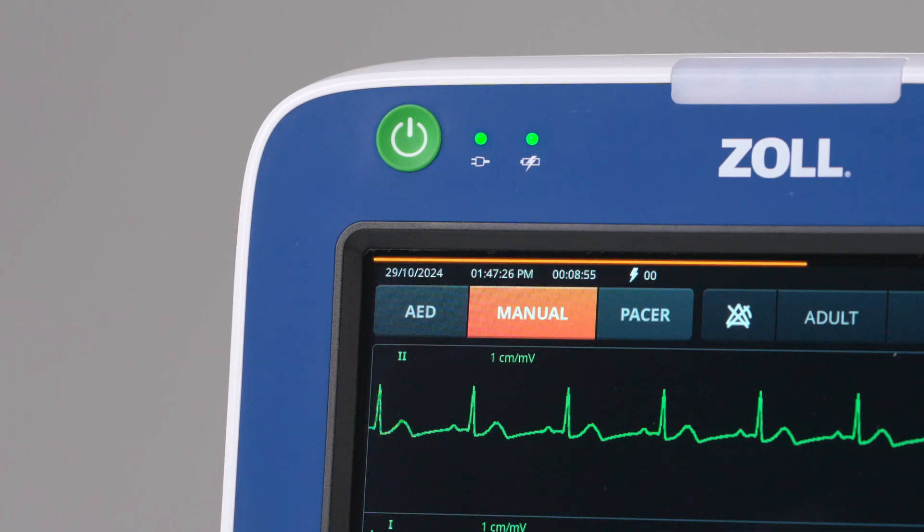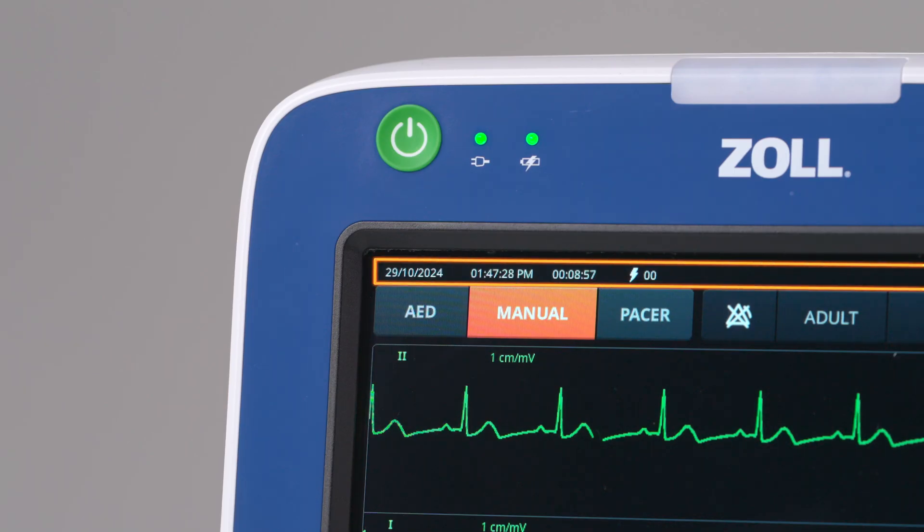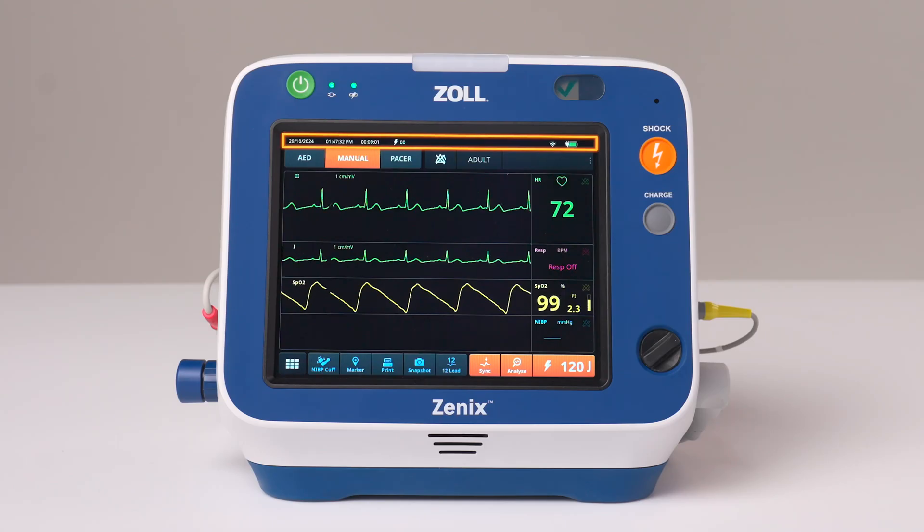The status bar shows the date, time, case time, shock count, Wi-Fi status, and battery level.